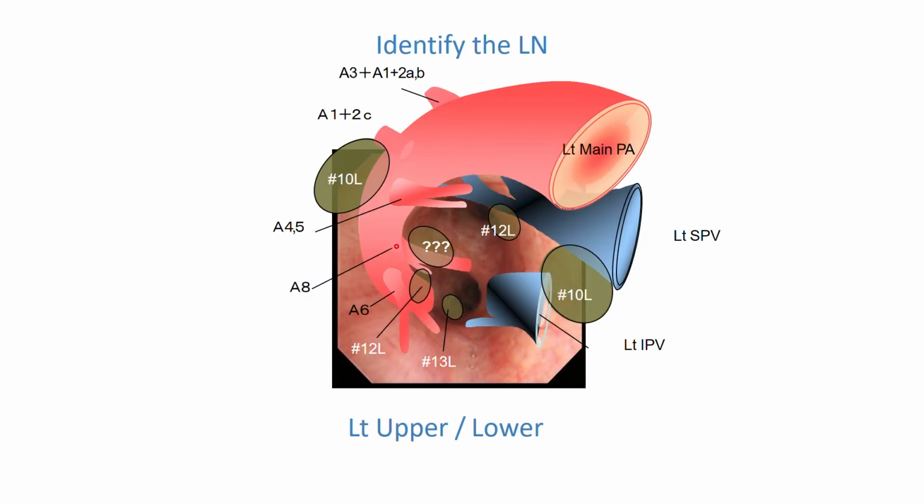Now we are inside the left. Any comments over here? That's our 11L. So a lot of this is something that you will catch up more with practice. The more you scan the nodes either on a model or inside a patient, the more proficient you will get with understanding these nodes. But what you need to know basically is the placement of the station 7, 4R and 4L.